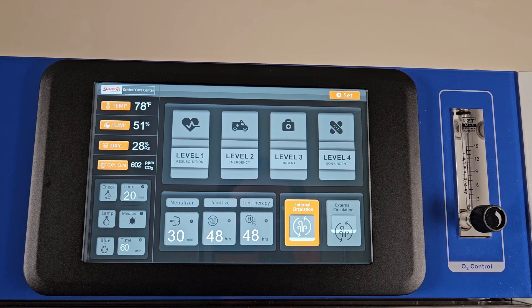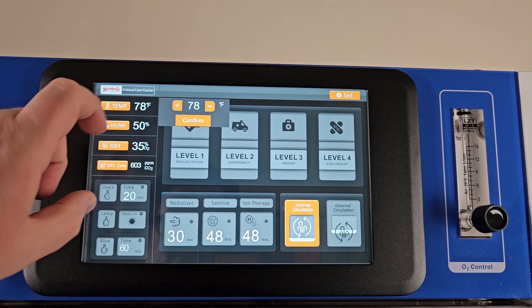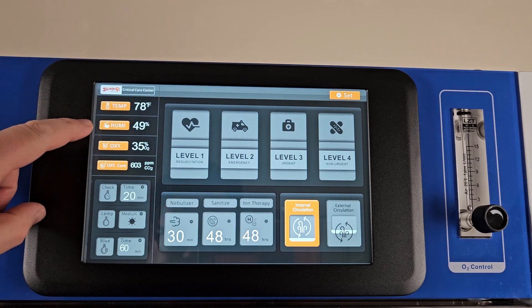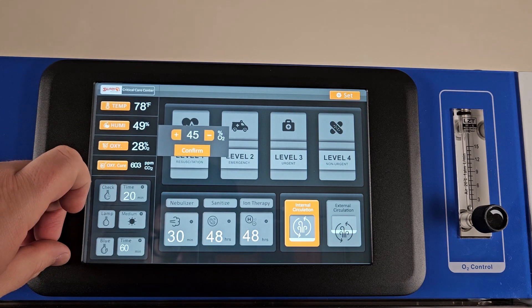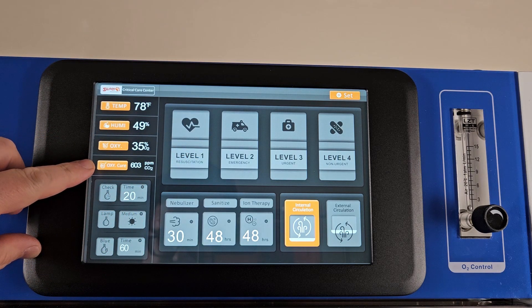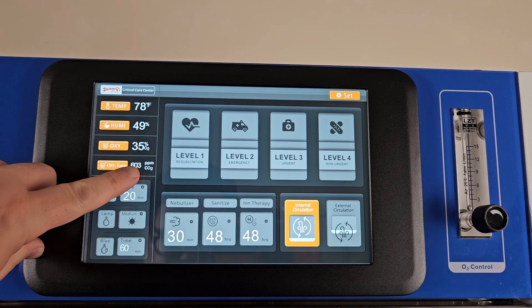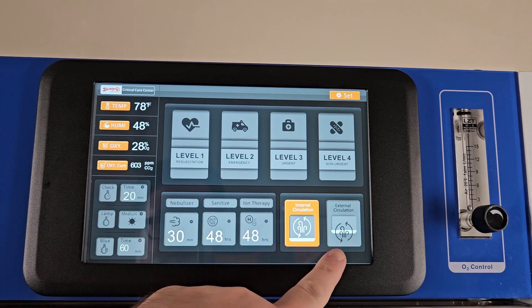You can control all settings for the unit using the touch screen at the top of the unit. Tap the temperature button to adjust the temperature in the unit. The humidity readout below this is just a reading of current humidity and cannot be changed. You can change the oxygen concentration in the unit by tapping the oxygen button and changing the concentration. The CO2 reading will display the current level of CO2 in the unit. If the CO2 reaches or exceeds 2,000 parts per million, the unit will automatically switch to external circulation to allow for CO2 venting.